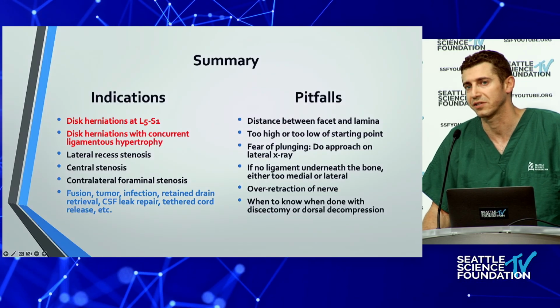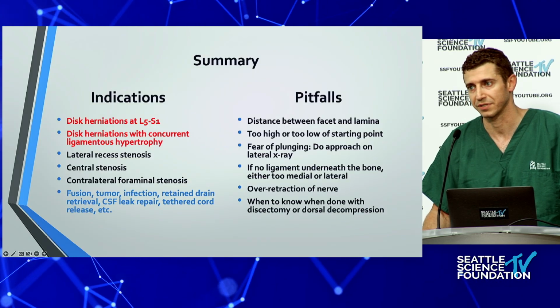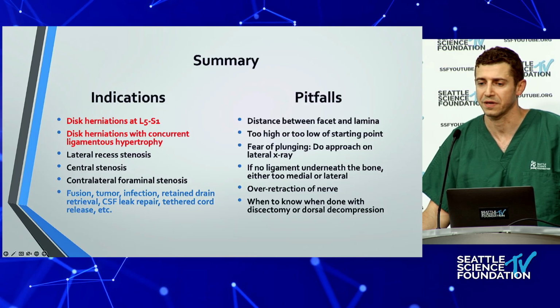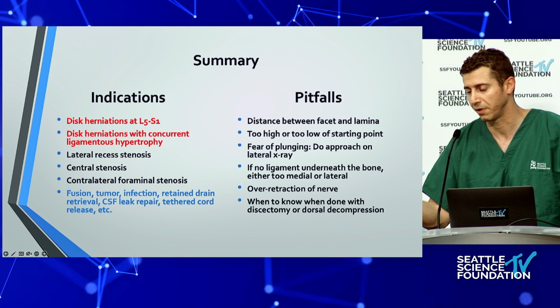I think I've had some of my stenosis patients when I first started, they were taking forever. When I got durotomies, they woke up super confused, and then they were in the hospital for a couple of days rather than going home. So once you get a durotomy, lower your pressure as low as you can for the bleeding not to be a problem.